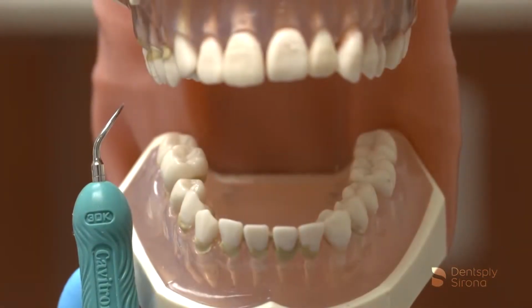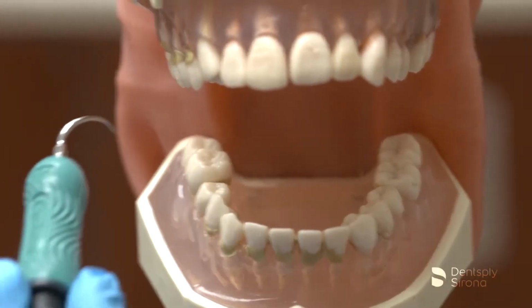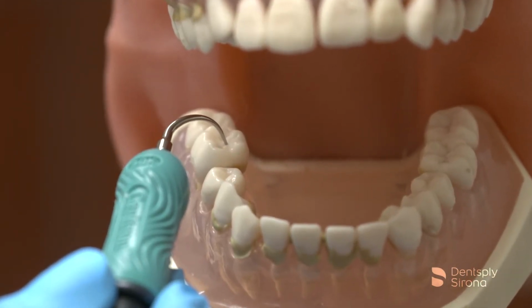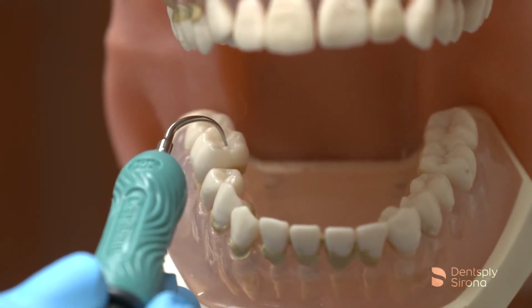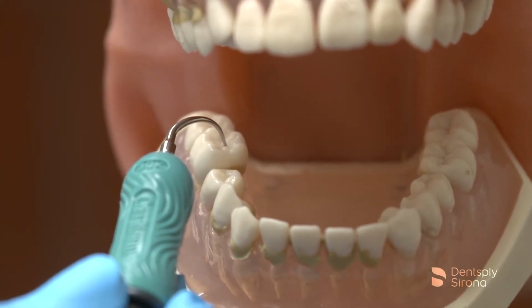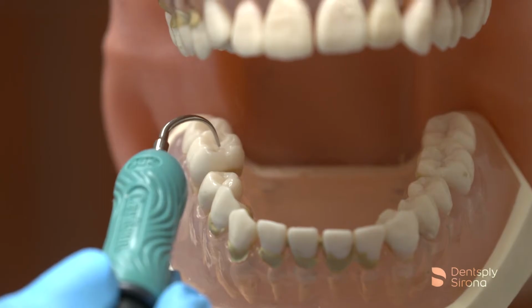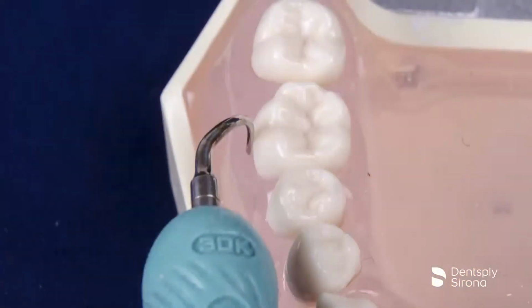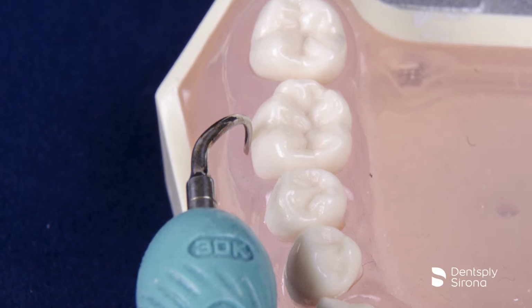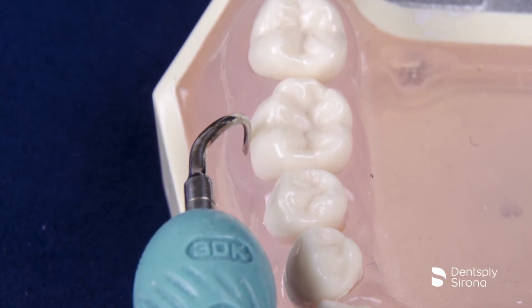It is also helpful to place the insert on the occlusal of the intended tooth, as demonstrated here, to see the curvature to ensure you selected the correct insert. After this is established, maintain a vertical approach and notice that the back of the insert is adapted to the surface you are entering. Utilization of all surfaces is indicated for proper adaptation in periodontal pockets interproximally.